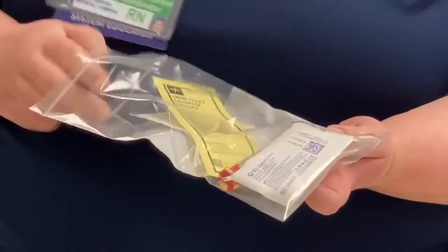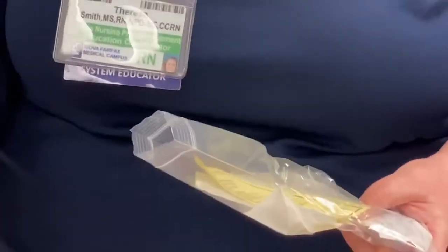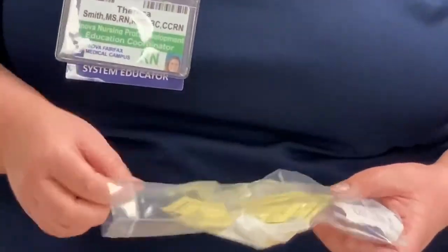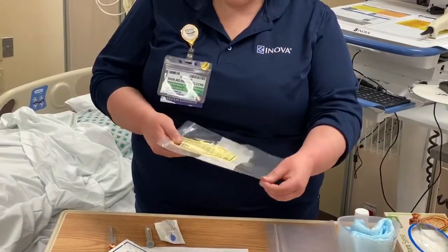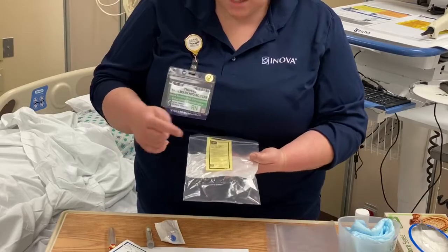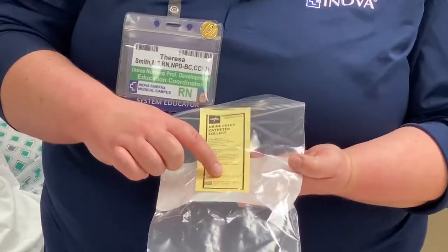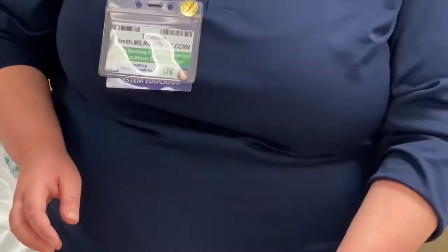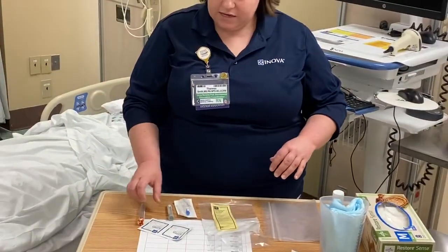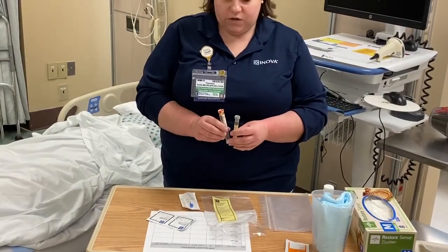Inside of this kit, you'll find 2 tubes, some alcohol wipes, and a transfer device. When you're looking for the expiration date on your supplies, you can actually just look at this yellow paper right here. It lists an expiration date, and that covers all of your supplies. In my kit, I have a gray tube and I have a yellow and red tube.